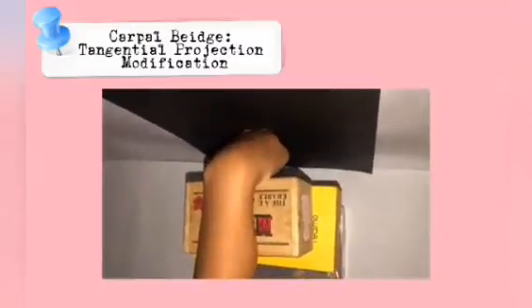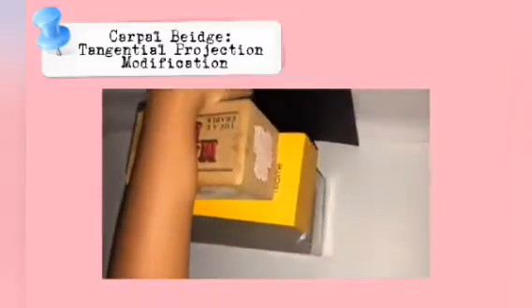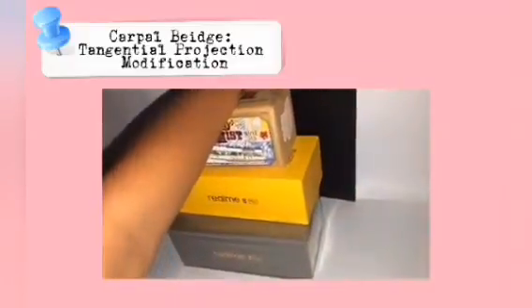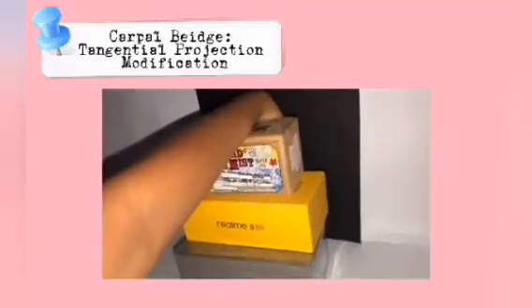Position of the patient. Seat or stand the patient at the side of the radiographic table to permit the required manipulation of the arm or X-ray tube. Position of part. The originators of this projection recommended that the hand lie palm upward on the IR with the hand at right angle to the forearm.